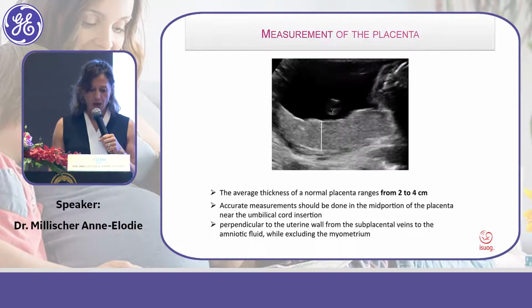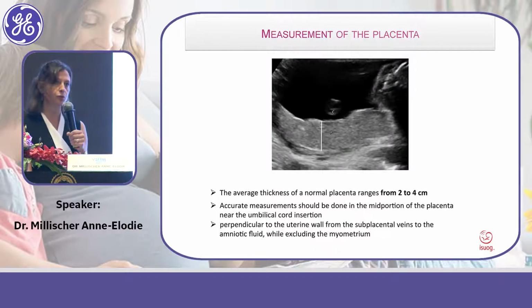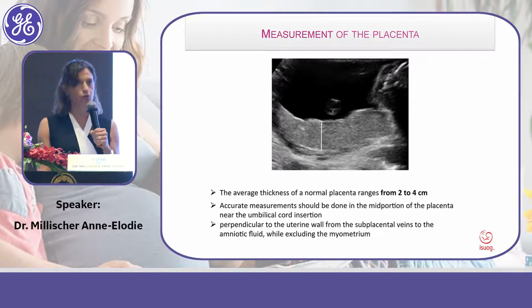We said that the normal measurement was around 2 cm, 2 to 4 cm.